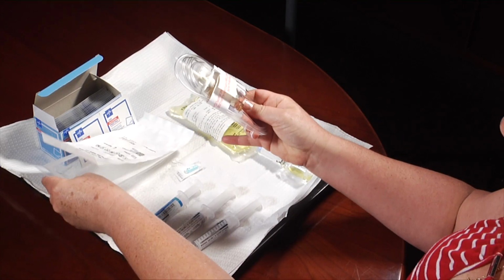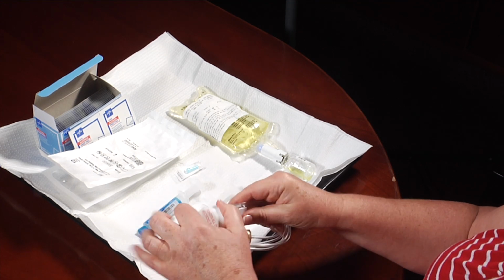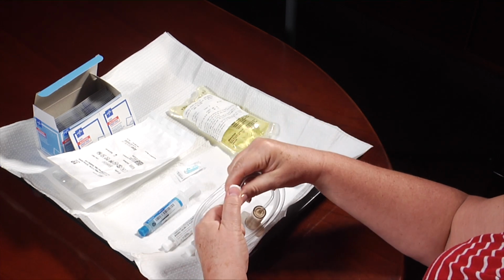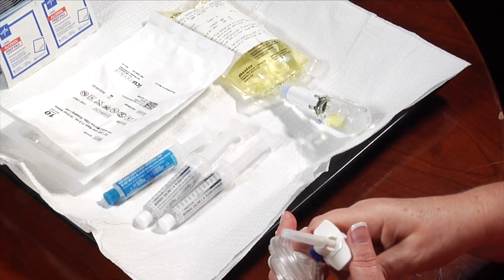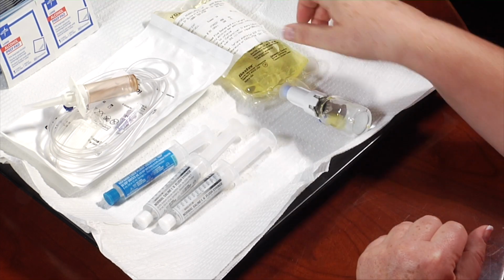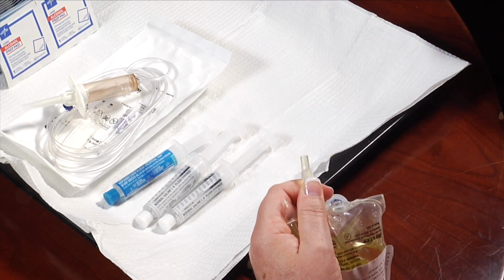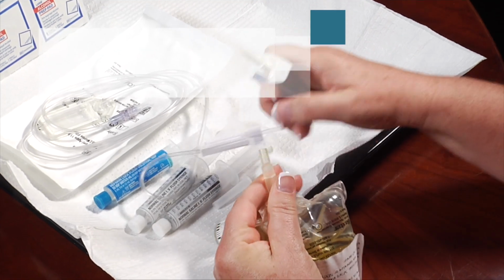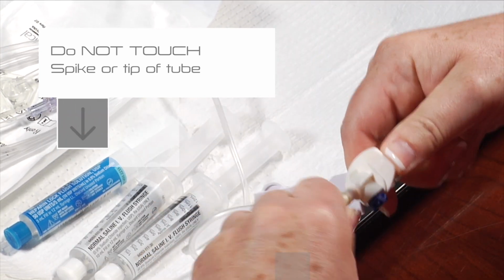Remove the tubing with filter from the package and close the roller clamp. Remove the protective tab from the entry point on the medication bag. Remove the cover from the spike on the gravity tubing and insert the spike into the medication bag using a pushing, twisting motion. Do not touch the spike.